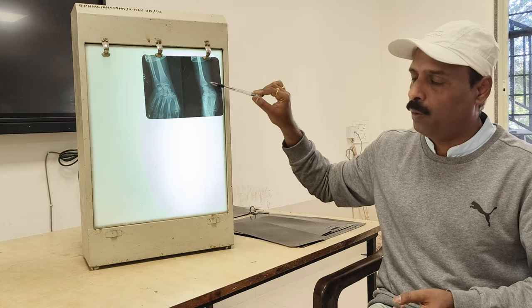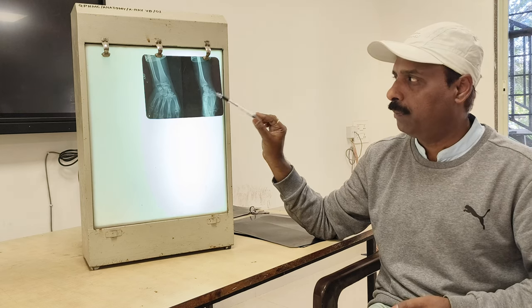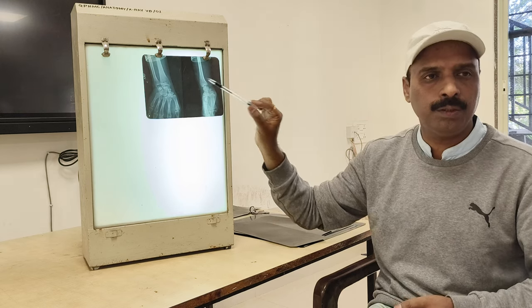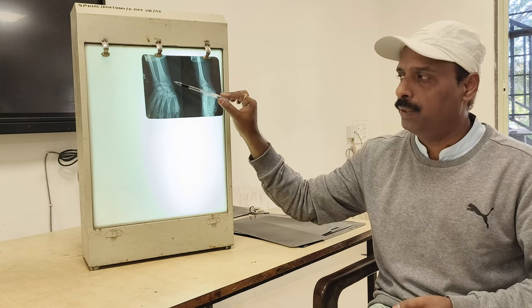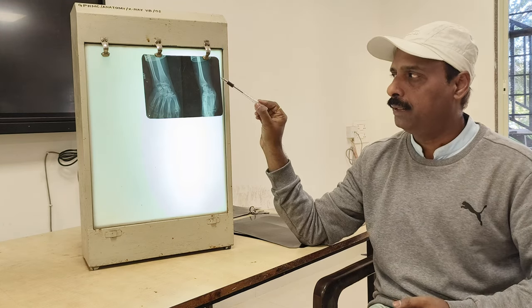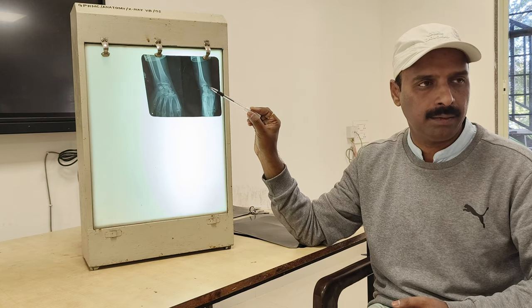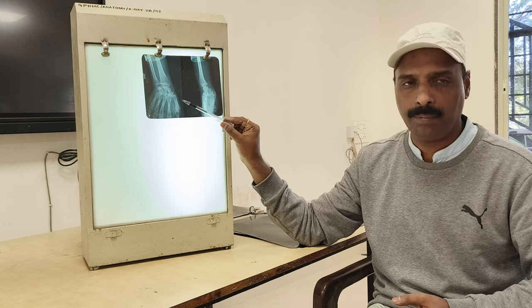This is the lateral view of the wrist joint, which you have to remember. It is very important to diagnose the Colles fracture, where we get the dinner fork deformity. That is one characteristic of the Colles fracture, which you have to remember.